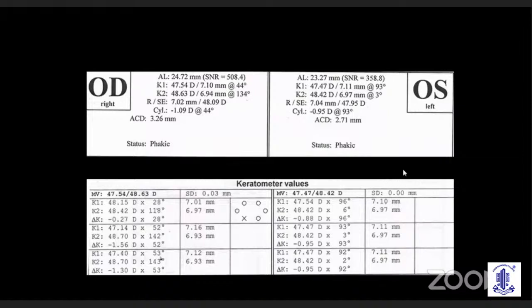As you can see here, the standard deviation is fairly good. Nothing too much to say. The validation window is actually perfectly fine. No error marks here. And the average of the K1, K2 value and the axis is perfectly matched. We'll come to the right eye.